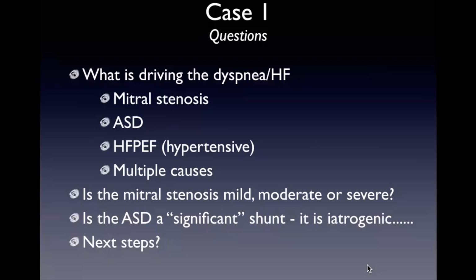And because of that, it's not a class 1 indication per se. It might be a class 2A/2B, but potentially it could be useful.